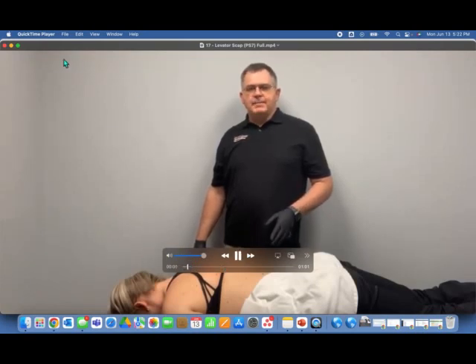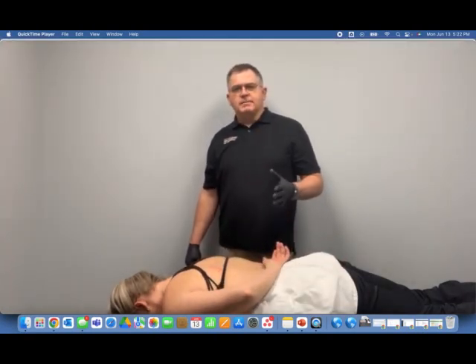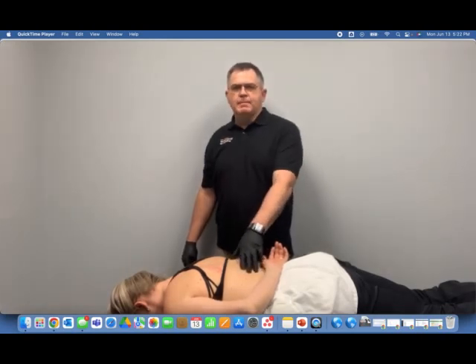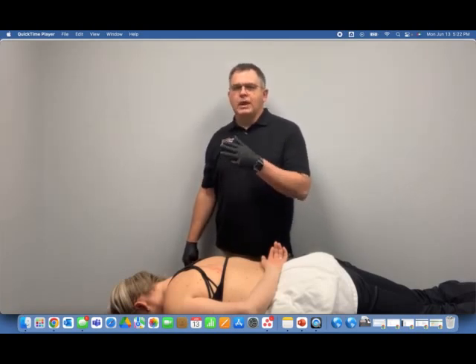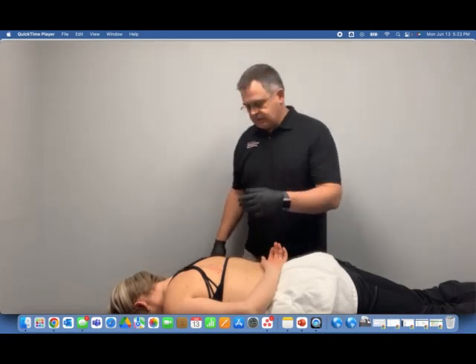For the levator scapulae, the patient is in the prone position, hand behind back. Needle length is about 3 centimeters. There is no backdrop. With the patient's hand behind the back, we're going to use that pincher grip to grasp the musculature at the superior angle of the scapula. We're going to needle through the attachment onto the scapula from an inferior medial to a superior lateral direction along the plane of the rib cage, using your fingers as a backdrop.